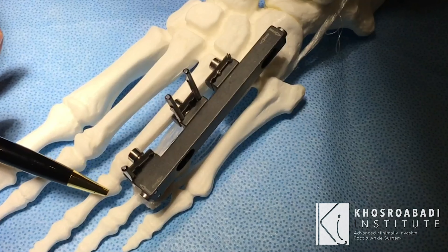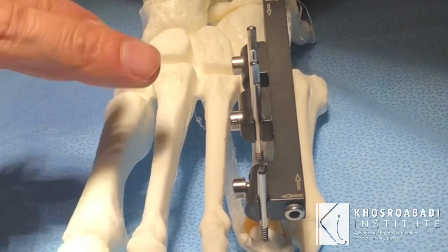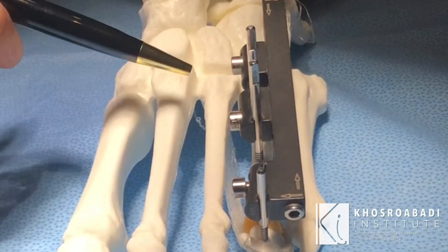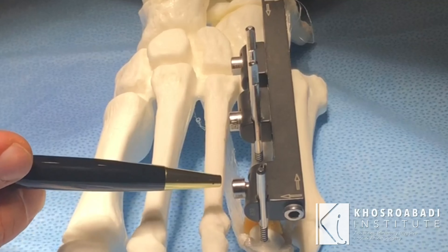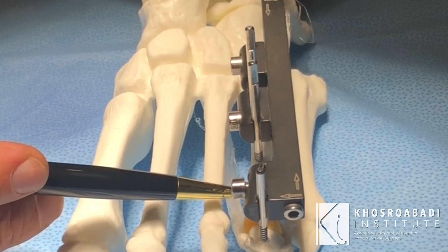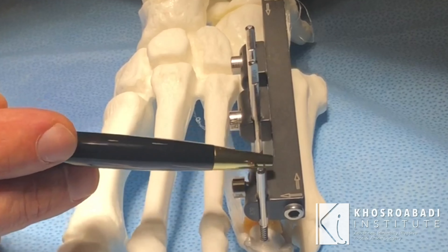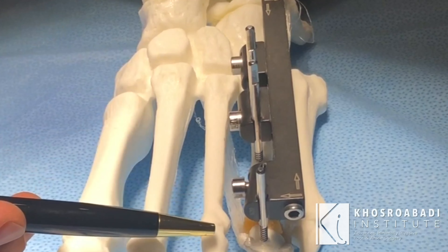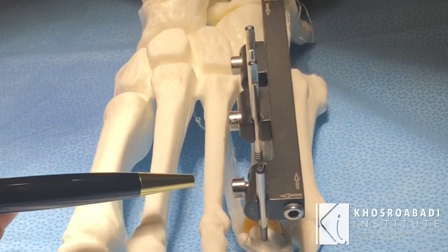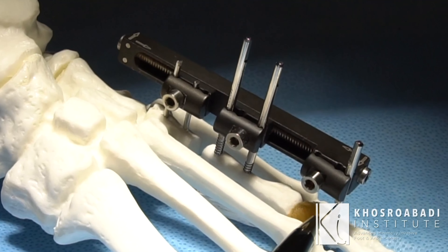The toe stays where it's supposed to stay and moves with the external fixation as we are lengthening. With this construct, the joint stays very healthy and intact. When we are done with the lengthening and remove the external fixation, these patients can move their toes easily and there is no need for any additional surgeries.